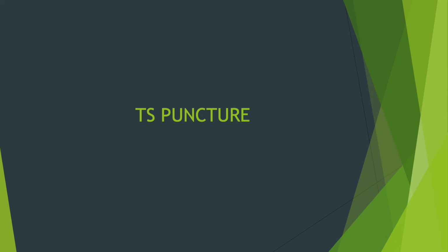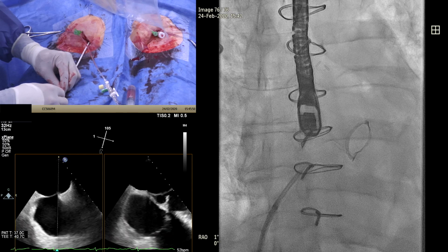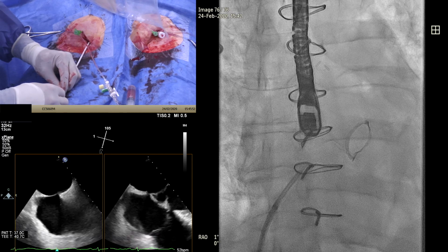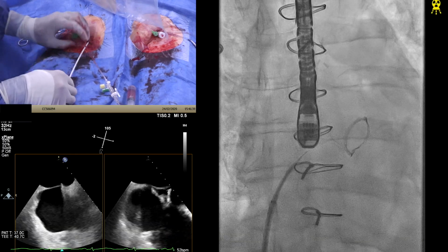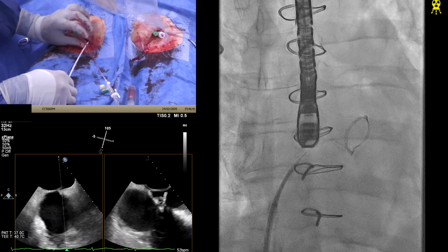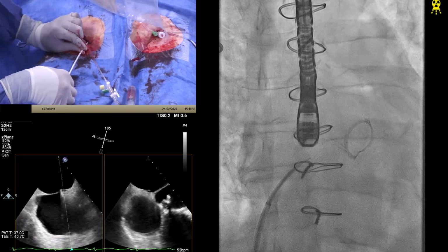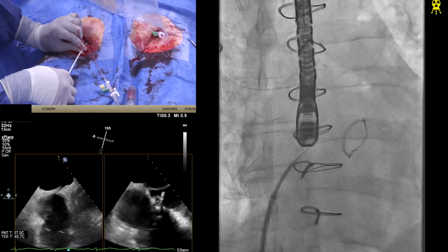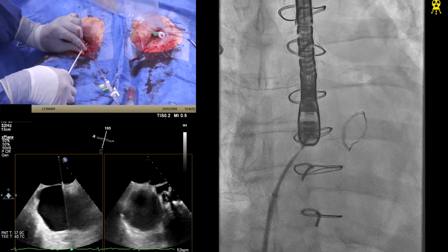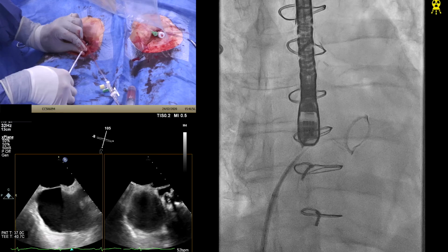We can see the needle in the middle of the septum on the anteroposterior view, which is away from everything, and that looks a very good position. I think we should be through there. So there's a big dent occurring, but I think it hasn't quite popped through as yet. So we'll maintain the pressure and try and just advance the sheath. And I'm being careful that as we let the heartbeat get this through, as soon as it pops through, I'm going to pull the needle back.